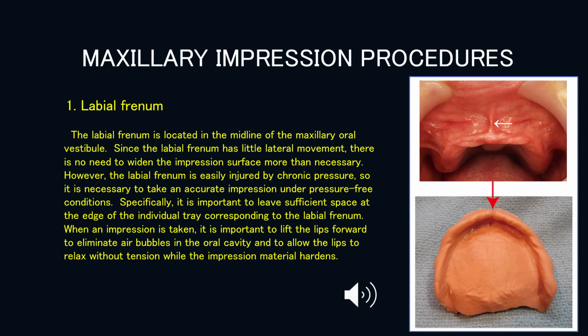It is important to lift the lips forward to eliminate air bubbles in the oral cavity, and to allow the lips to relax without tension while the impression material hardens.